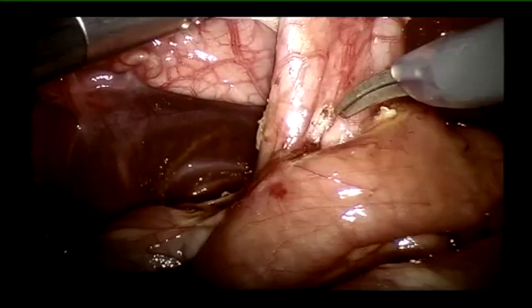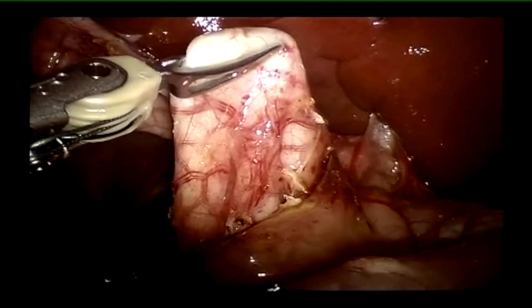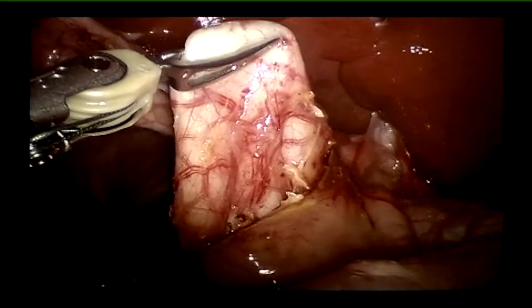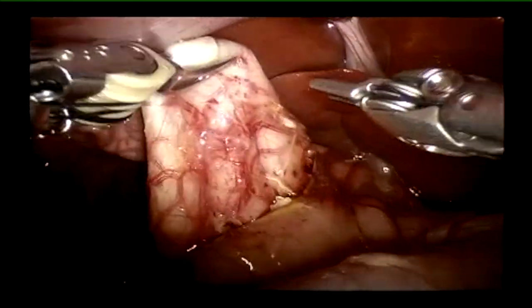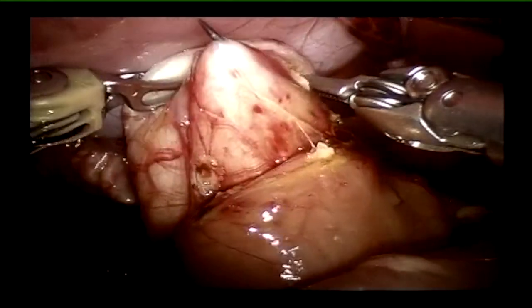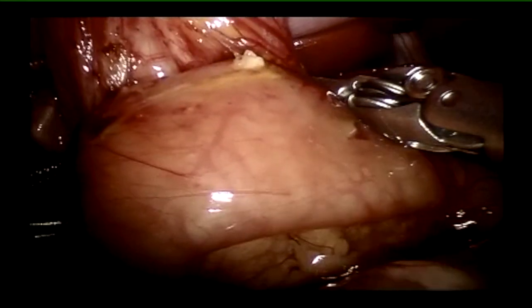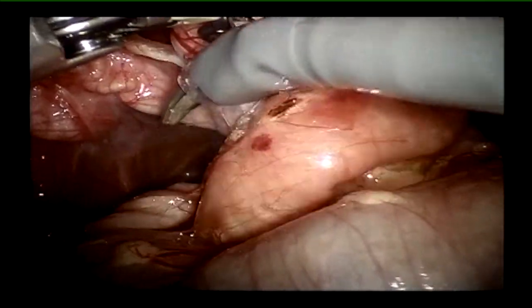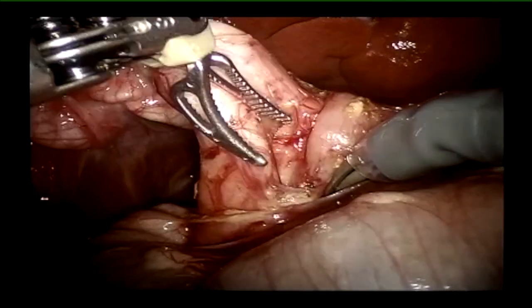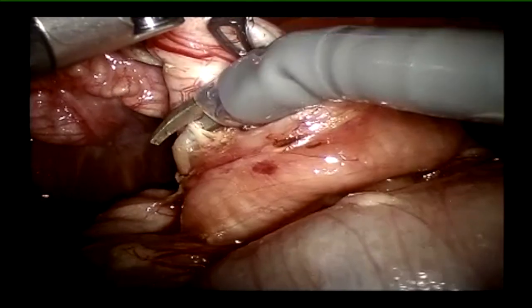As you can see, the vision is fantastic. Once you adapt to making small movements that accommodate within the available area, at no point will you feel there is insufficient space. We liberally use transcutaneous transabdominal stitches so that both hands are free for dissection. It was a large cyst, so we decided to hang the cyst to the abdominal wall as well, leaving both instruments free to dissect the cyst fairly clearly.